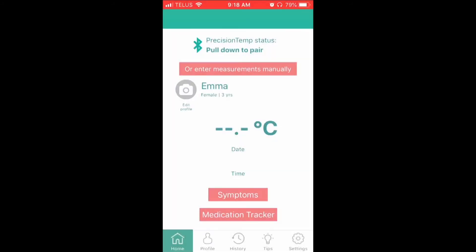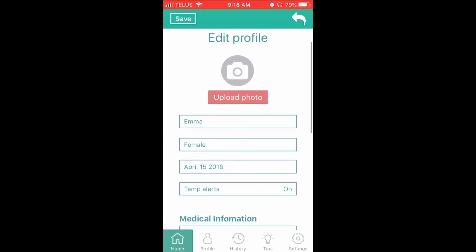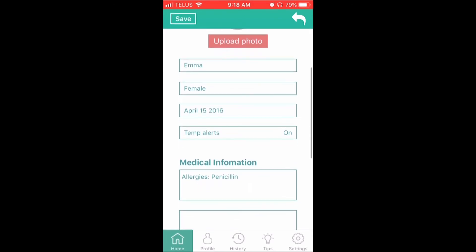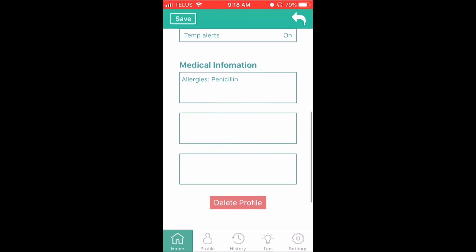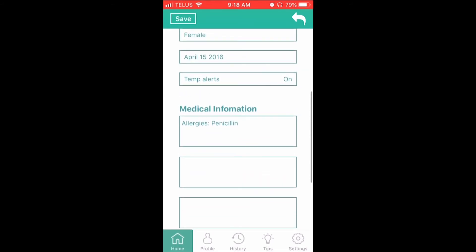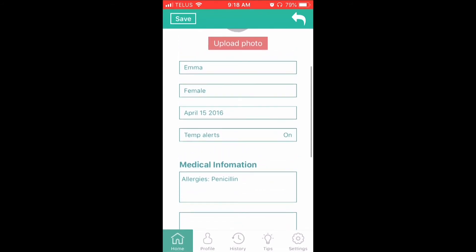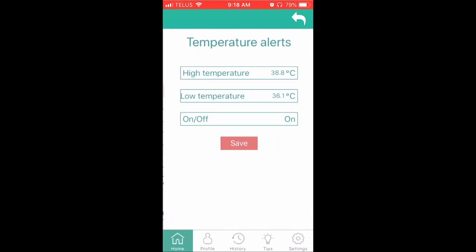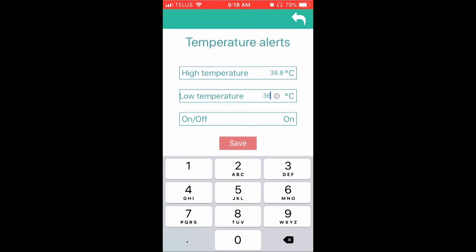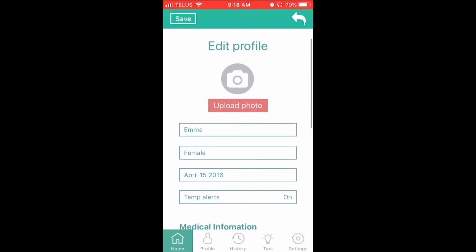At the top left-hand side of the screen is the name, gender, age, and image of the selected family member profile. To edit that profile, tap on Edit Profile located under the image. Here you can modify the profile's information. Click the Save button at the top left to save the changes. If you do not want to save your changes, select the back arrow located at the top right of the screen. This will take you to the Home screen.